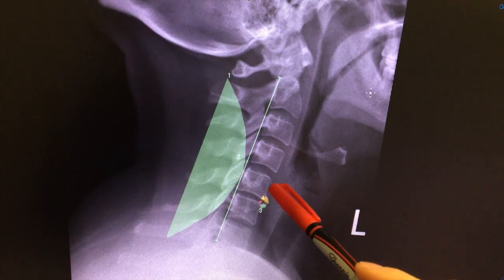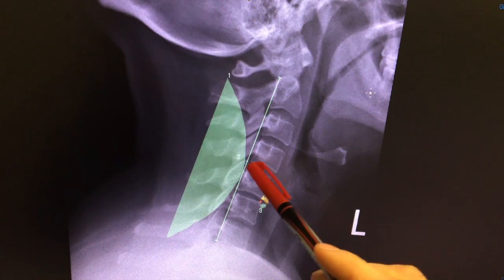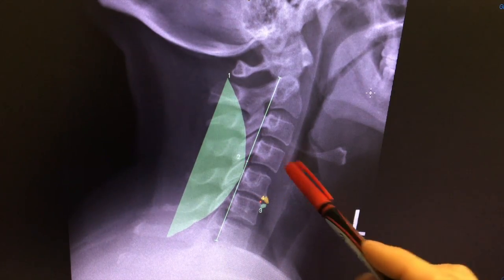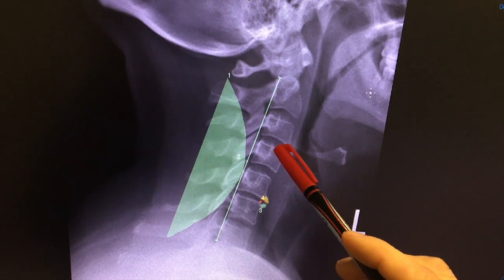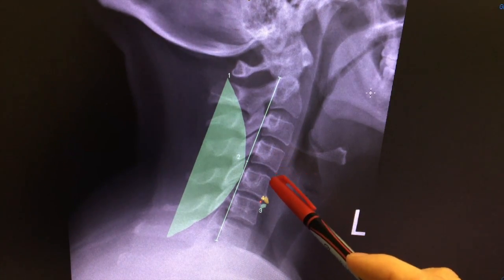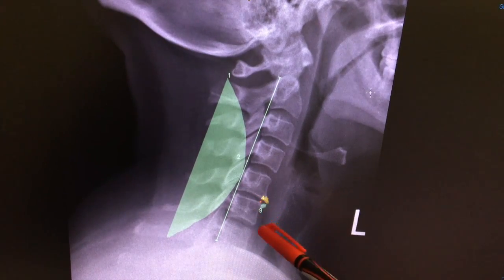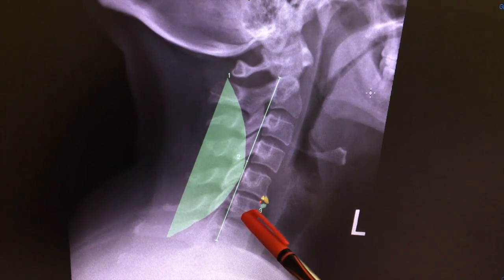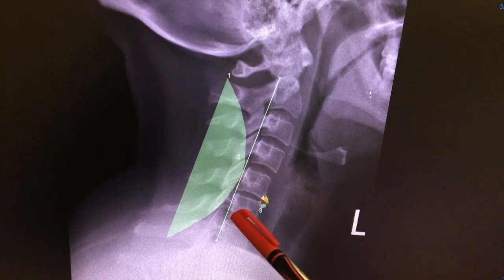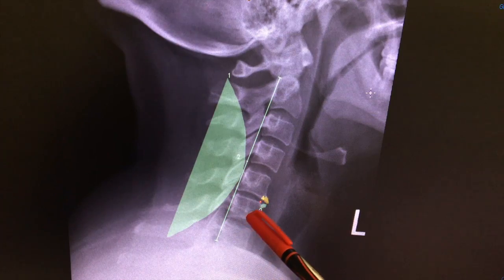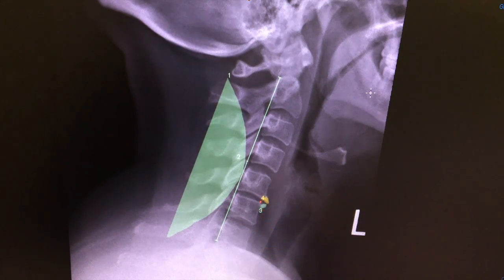We're also looking for a nice fat disc space. The disc space, which allows the nerves to come out, should be nice and wide — you can see that here — but down here it's starting to thin and narrow, so that would be some degenerative disc disease happening there with some bone spurring in the front.